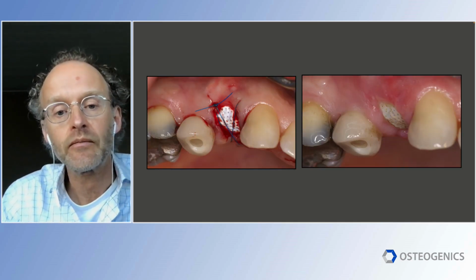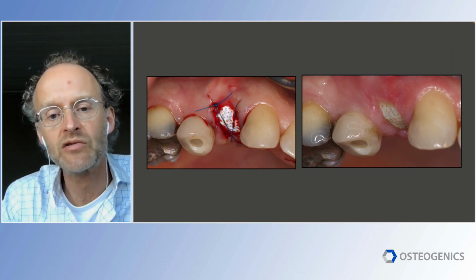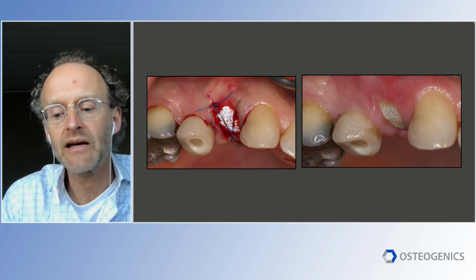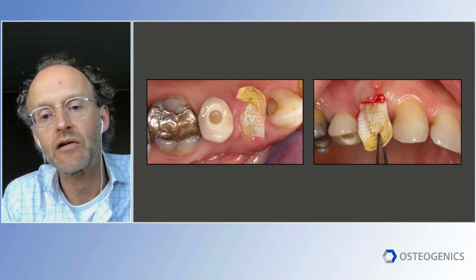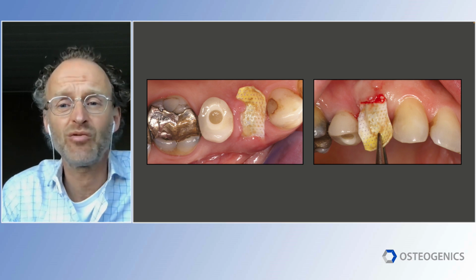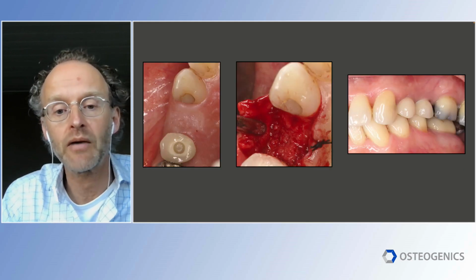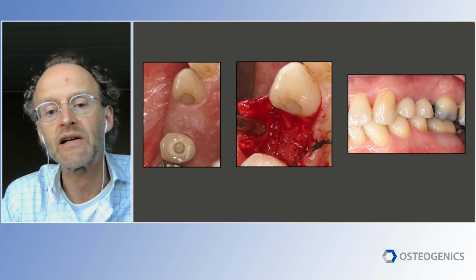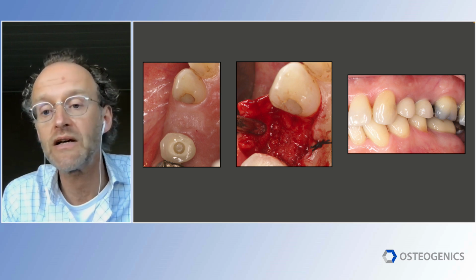But an example. Patient treated here on the left, after extraction, membrane in place. On the right, 2 weeks after extraction, we took out the sutures. Nowadays, I take them out later. But then, another 2 weeks later, so 4 weeks after extraction, we see the exfoliation of the membrane. But then, can you really call it a complication? I mean, you take out the membrane, and then after 4 months, you still have the luxury amount of keratinized tissue, and you can place your implant. And on the right, you see the implant crown after 3 years in place.